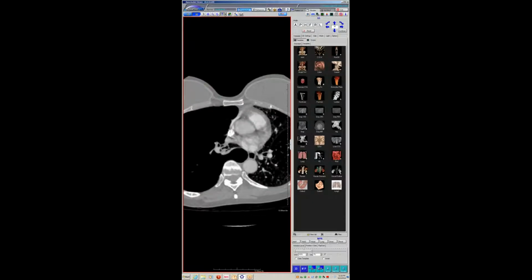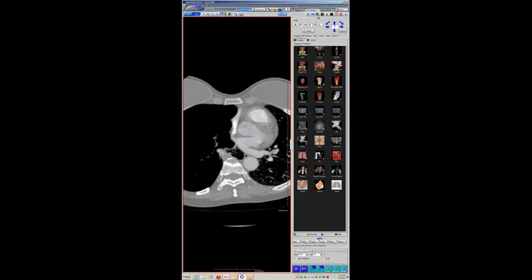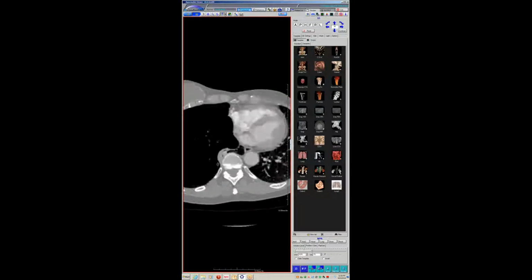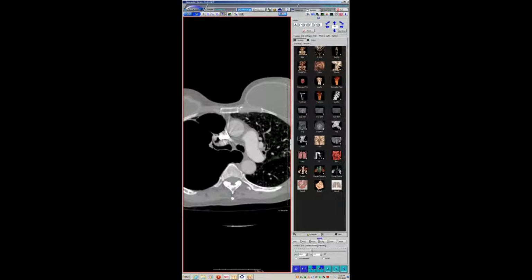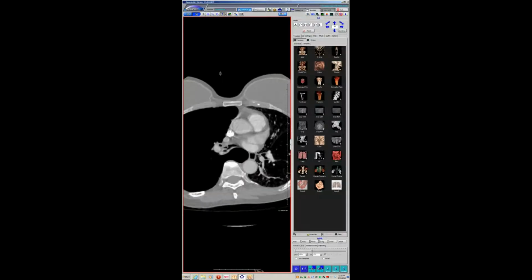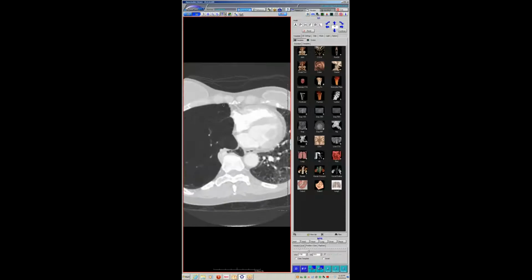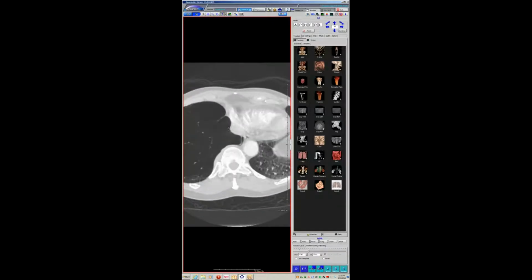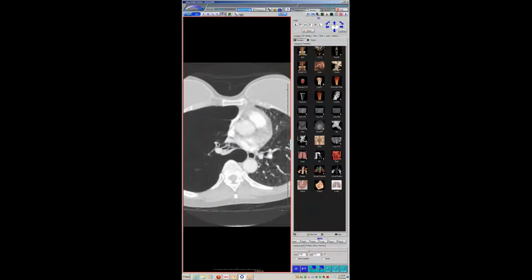But I would think that if this were congenital and had been there forever, then the vessels to the normal parts of the lung would never have grown normally, and they would be small. They would reflect basically the neonatal size. They would never have grown. And the fact that you've got respectable vessels suggests to me that this is really acquired. Interesting. Yeah, I've just never seen one. I was totally confused.